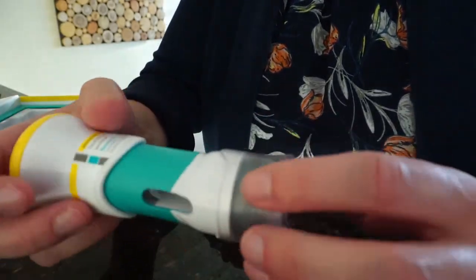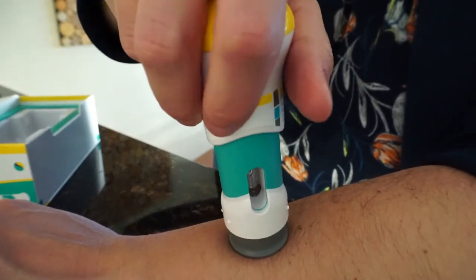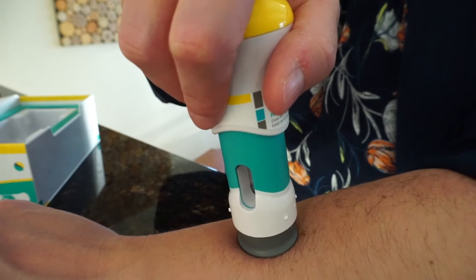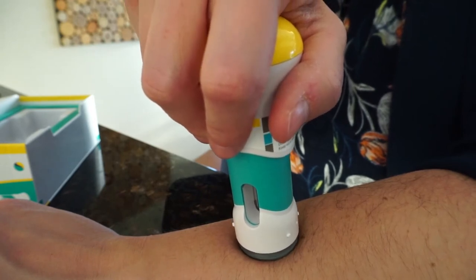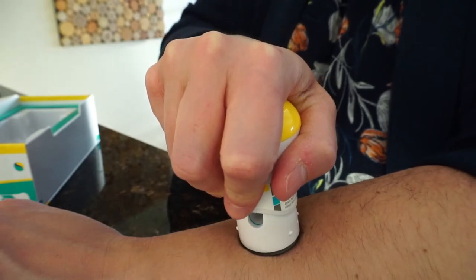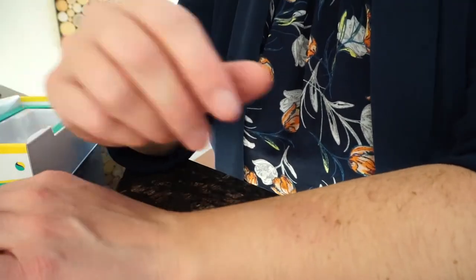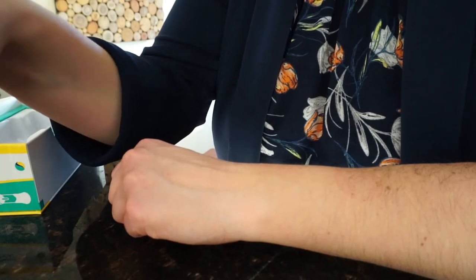Then take the medication, remove the safety cap, and hold the pen flat against your skin. You want the window facing toward you so you can see where the medicine is. Push very slowly over the course of about 10 to 15 seconds. When you hear a click, you're done. Remove the pen — you may have a drop or two of blood, which is normal. Put a bandaid on, place the pen in your sharps container, and you're all set.